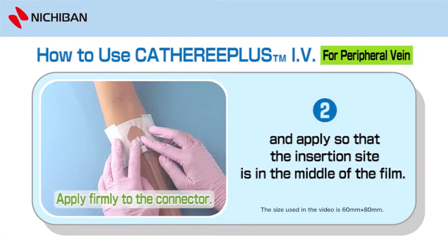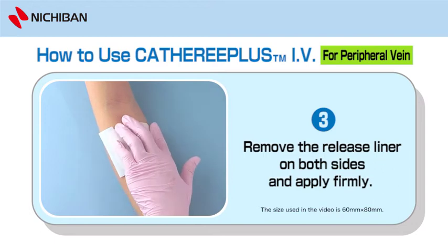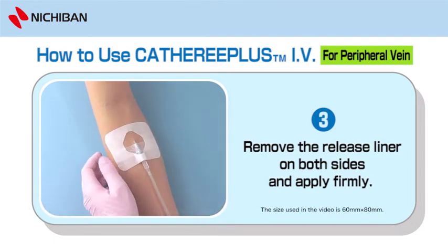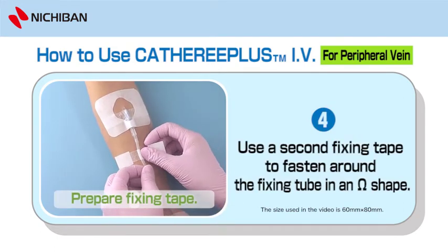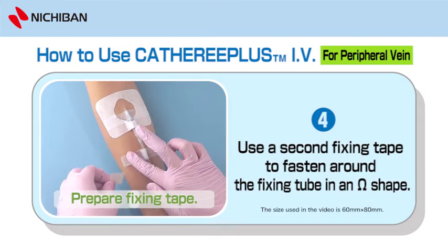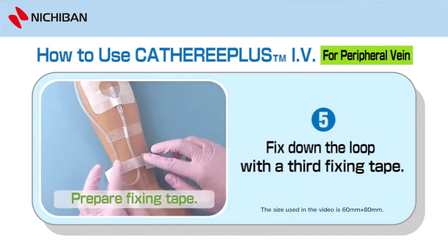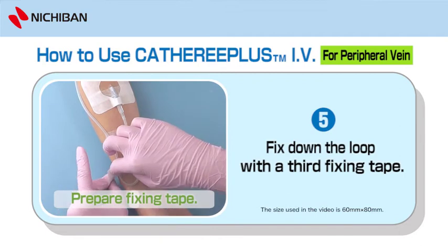Apply firmly to the connector. Remove the release liner on both sides and apply firmly. Prepare fixing tape. Use a second fixing tape to fasten around the fixing tube in an omega shape.